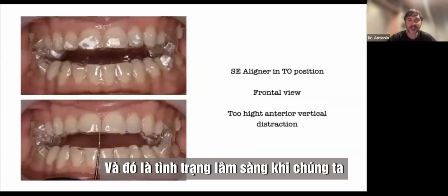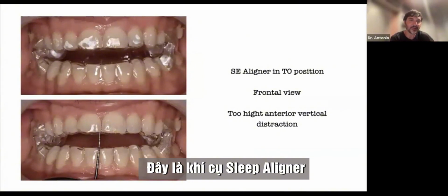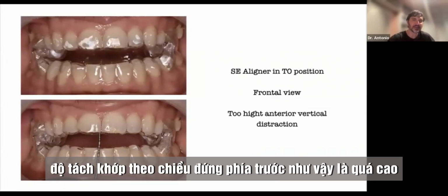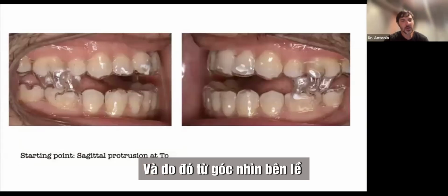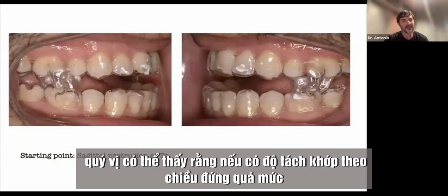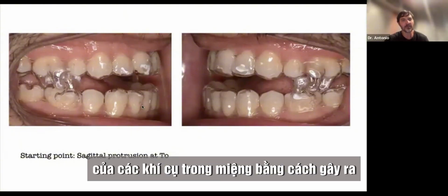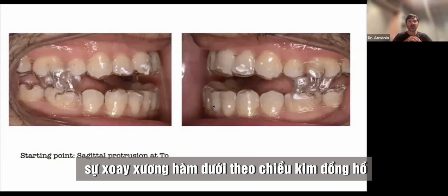And that's the clinical situation when we give the device to the patient. This is the sleep aligner in the starting position, the frontal view. And for me, the anterior vertical distraction is too high. And so from the lateral point of view, you can see that if you have an excessive vertical distraction, it decreases the effectiveness of the oral appliances by causing clockwise mandibular rotation.